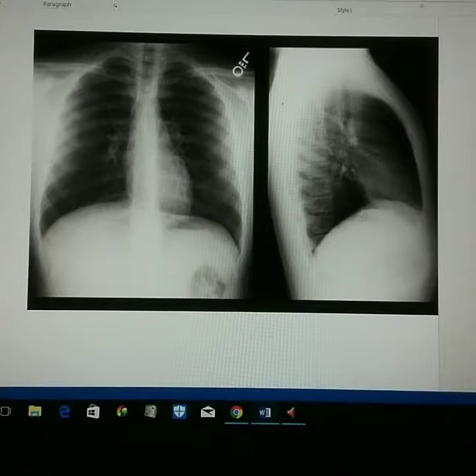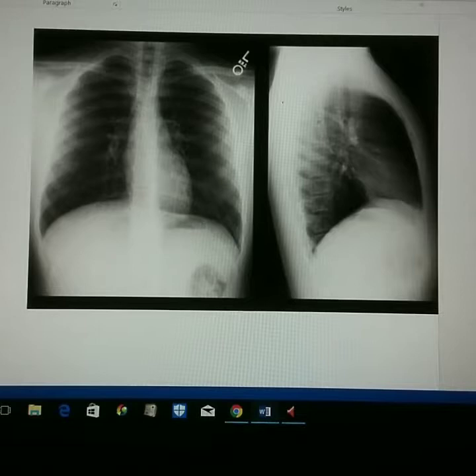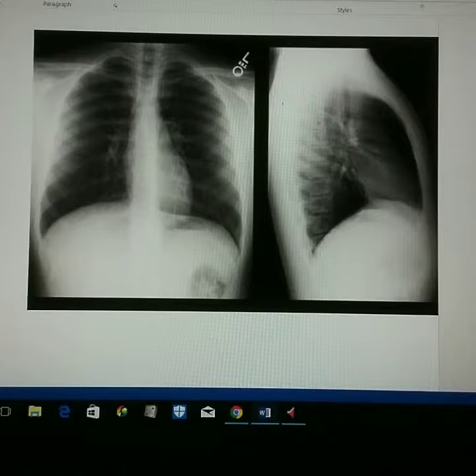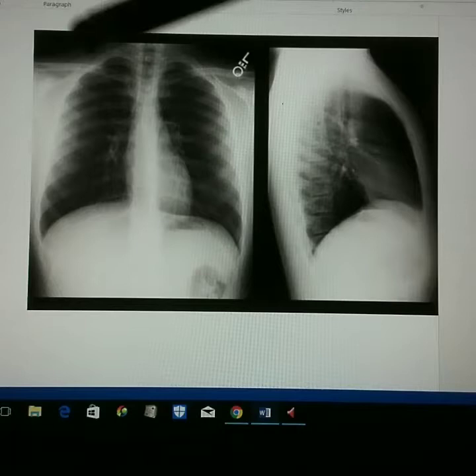Proper shoulder rotation should be evident by the scapulae being projected outside of the lung fields, so we have no scapula within the lung field. We also want to make sure we have good sharp outlines of the heart and diaphragm.